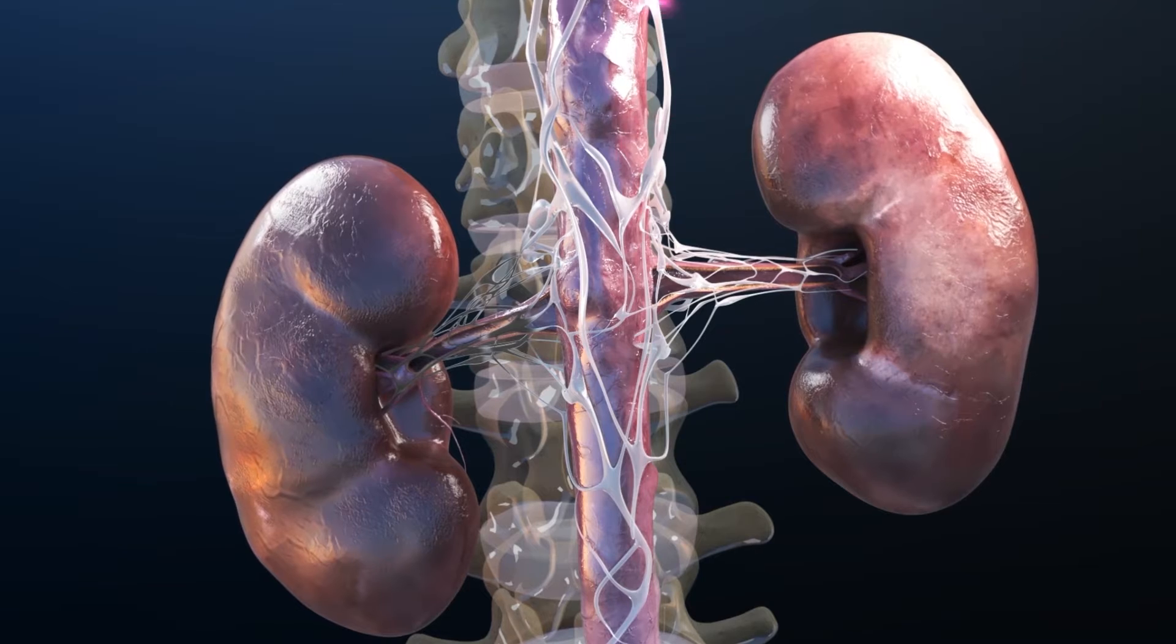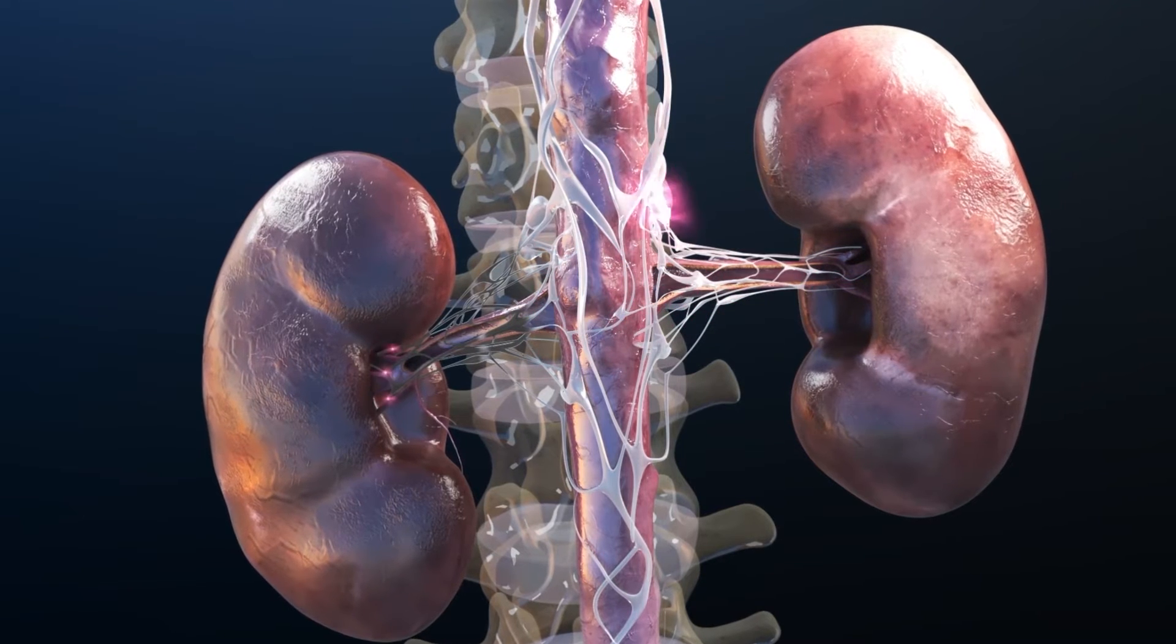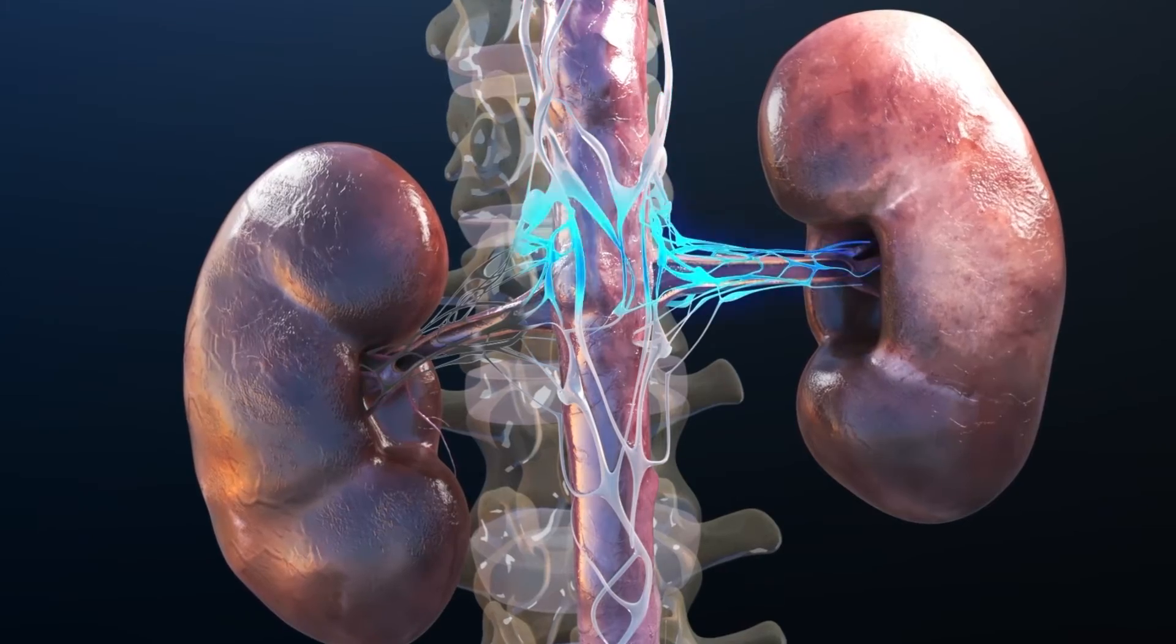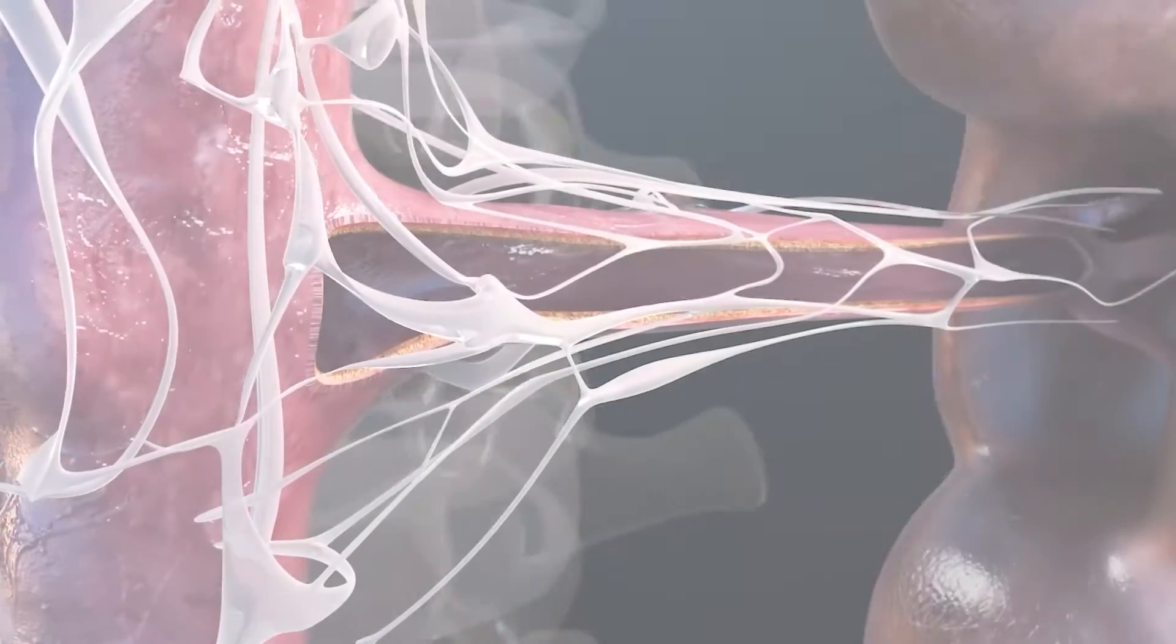As a result of delivering ultrasound energy circumferentially within the main renal arteries, sympathetic nerve activity is interrupted to achieve a lasting reduction in blood pressure.